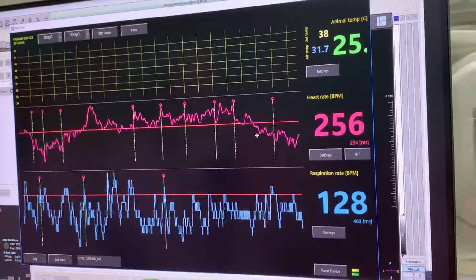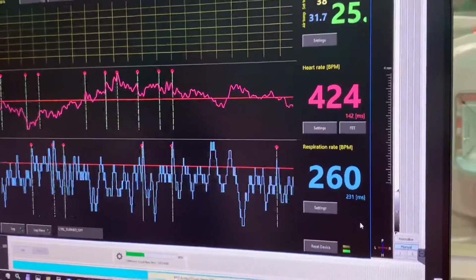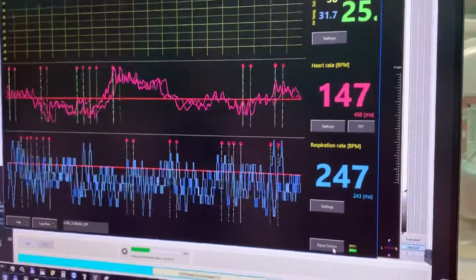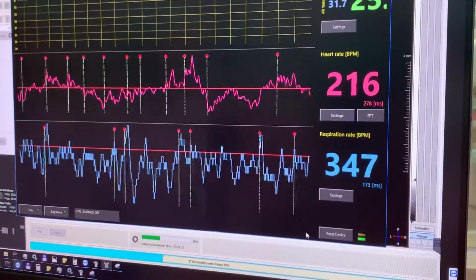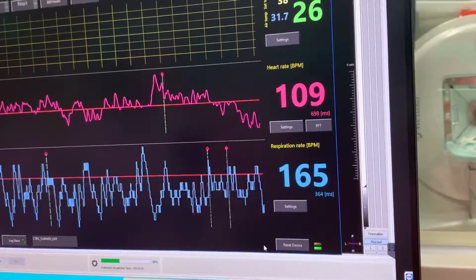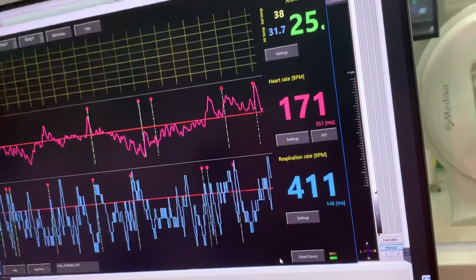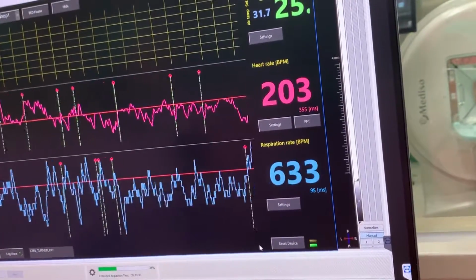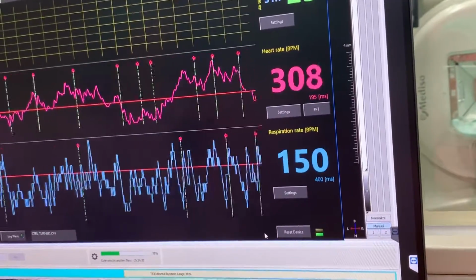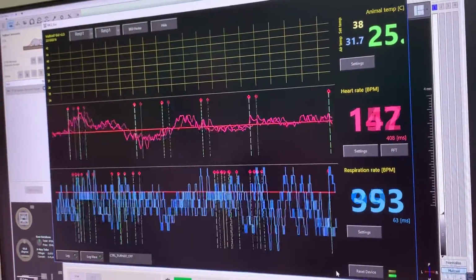Okay, and if you miss some information, like temperature curves, just press the reset device. There is a multi-cell controller inside the gantry, which is something like what I mentioned regarding the gantry computer. So it resets that device, and the signal just magically comes back.